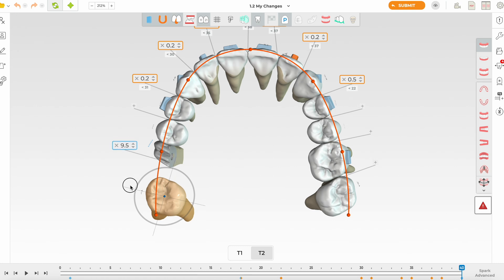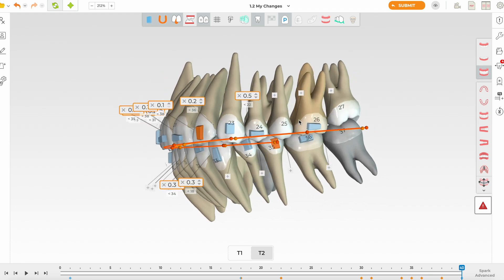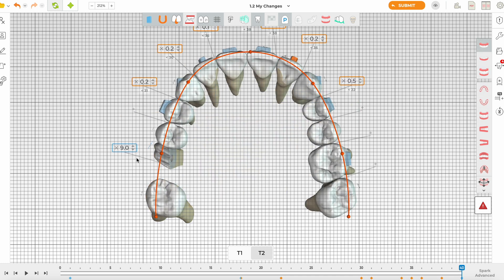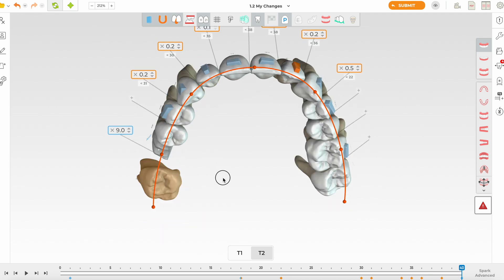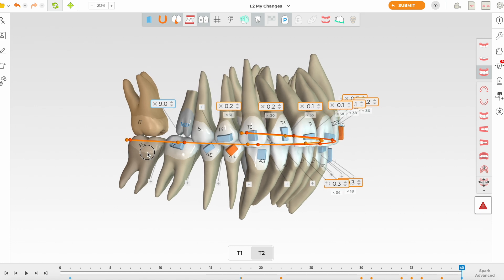We can measure the space — each square is a millimeter — and make it similar to the 2.6 for symmetry. I'm happy with the 7's position now. Before locking it, I'm also going to add some buccal root torque. Then I'll lock this tooth, setting the final position of this molar.